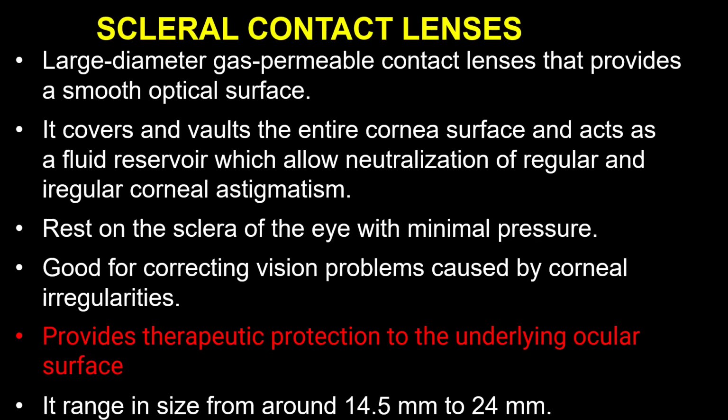And because of the fluid, it's like pouring oil. I remember those days back home, we used to pour water on the floor. If you pour water on the floor, you can almost swim on the floor. So that's what happens when you have the tear or the saline solution on top of the cornea and the scleral contact lens on it.